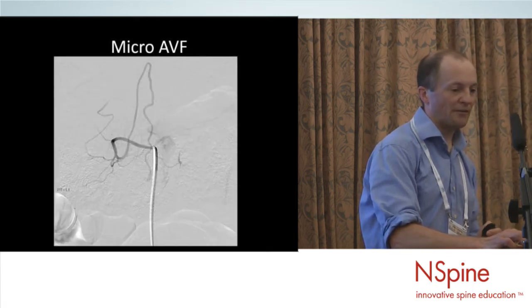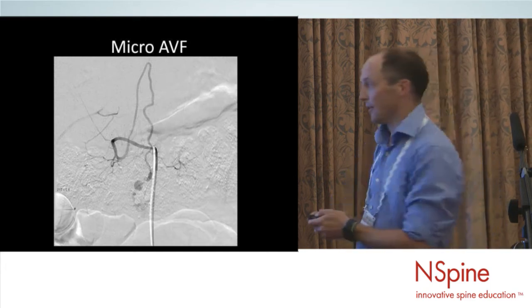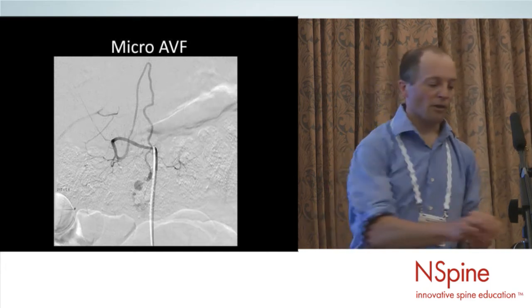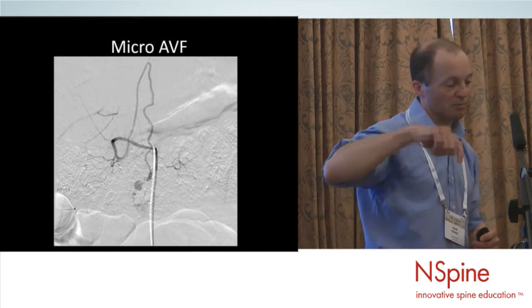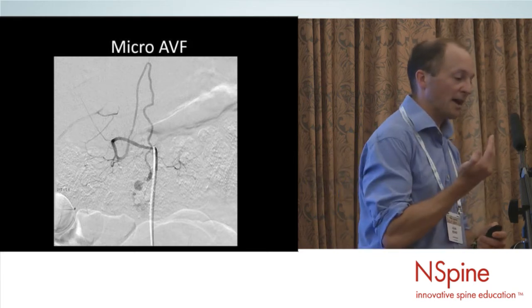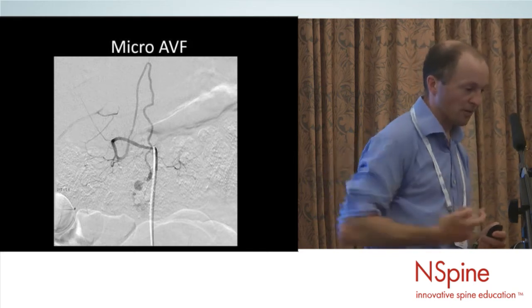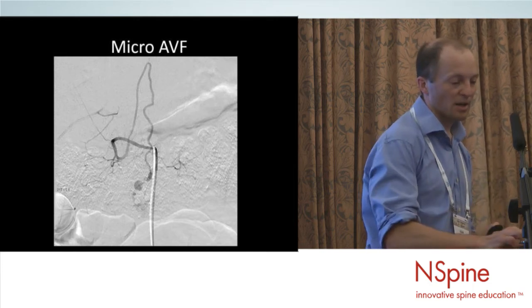And although I haven't shown it on these slides, that's the same magnified image of the same thing. This is a little surgical clip just here. Although I haven't shown it for the slides, if you inject the other segmental arteries that supply going round the conus basket and up again through posterospinal contributors, round the conus basket, back up again to the same fistulous point.